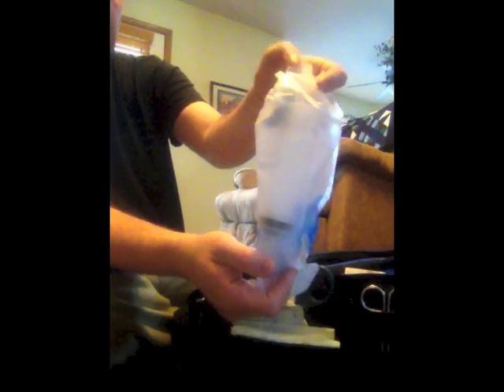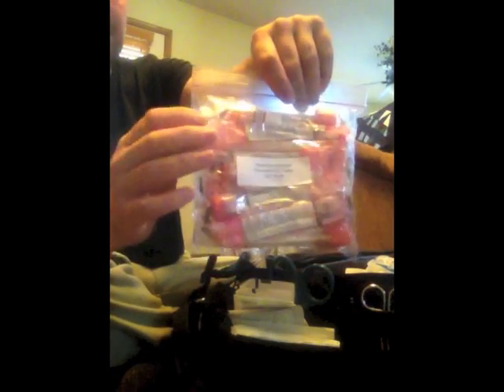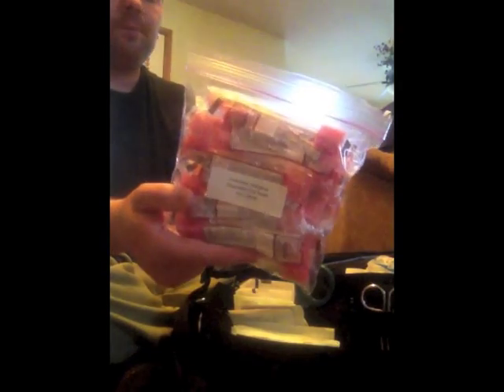These are irrigation syringes, and this is what I was talking about before, why I have those cups. I put the antiseptic wash in the cup and use the syringe. Also what I carry, I just got these lately, and not many people would carry these. These are what you see in the hospital. They're like little mouth swab things that people usually use in the hospital to keep their mouth moist. I like these because you can use them for all sorts of things, not only the mouth. You can use it if you're applying some kind of ointment on somebody, or if you need something to absorb fluid. I think these are great. They're universal.